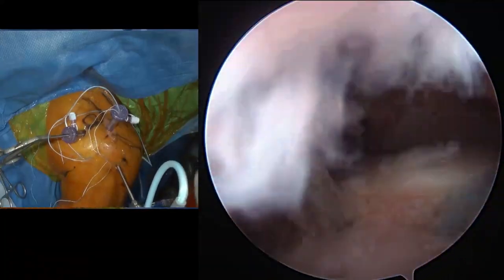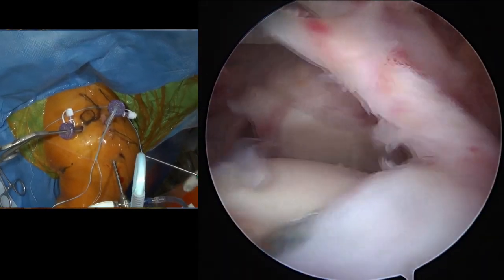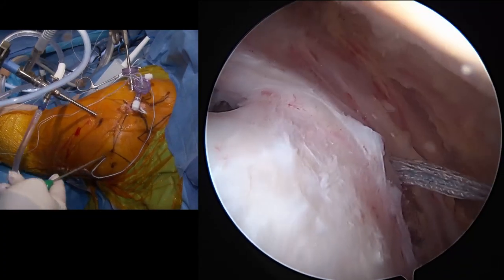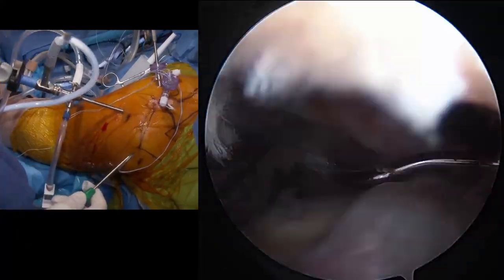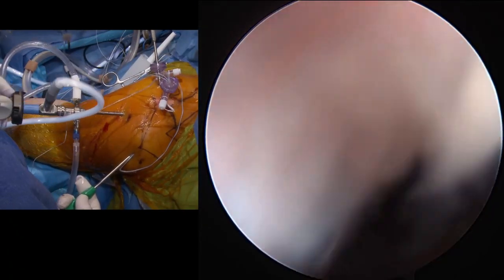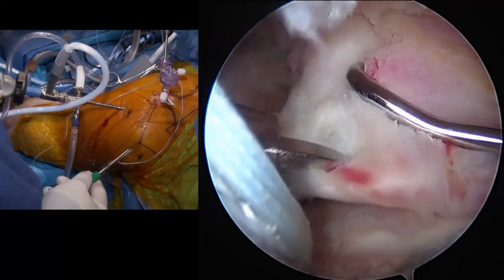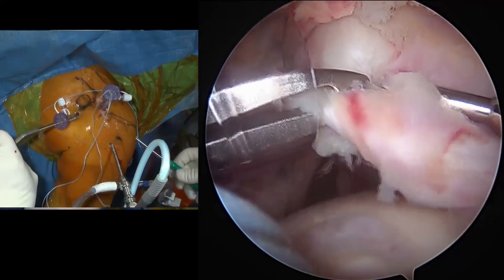Okay. Let's have our lasso. Just want to make sure we go through a comfortable spot here. I don't want to capture the other suture, so I just have to work around it a little bit. There we go. Hold the scope for a second. Let me just see where this goes. Hold the scope where I put it, right there. So we want to come out of here. Yeah, it's probably about right. We'll get a side to side out there.